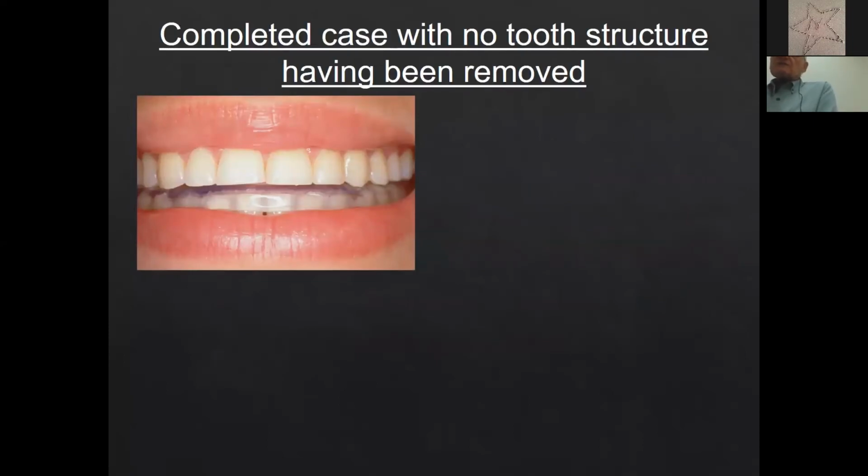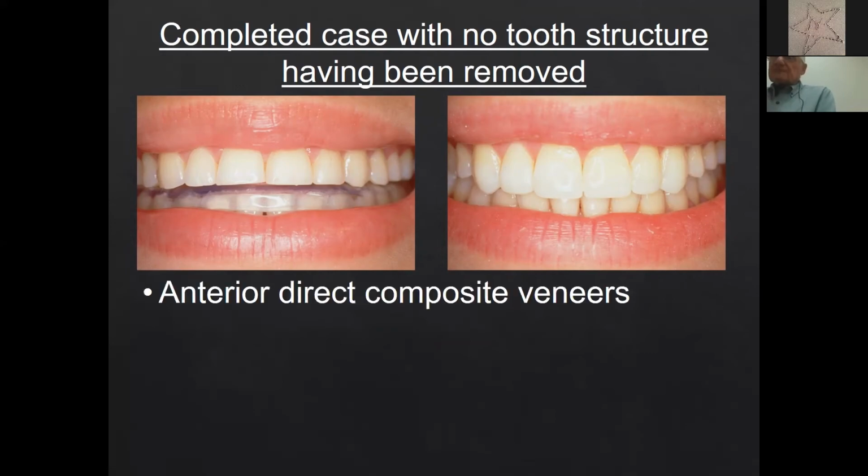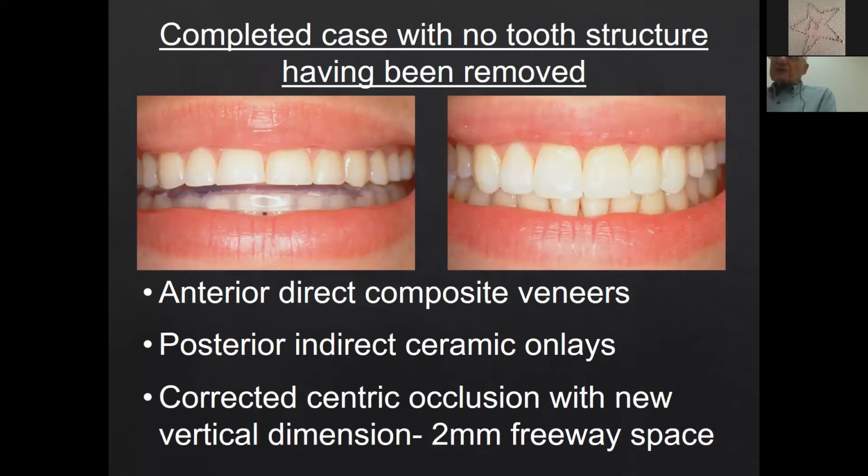So in conclusion, this is the before picture. This is the after picture. So we have anterior direct composite veneers, posterior indirect ceramic onlays, and we've corrected the centric occlusion with a new vertical dimension with a 2 millimeter freeway space.